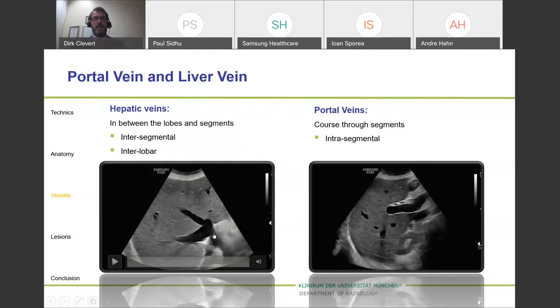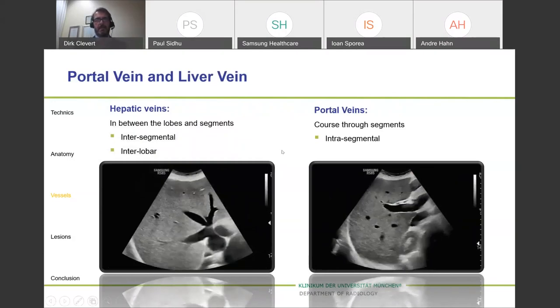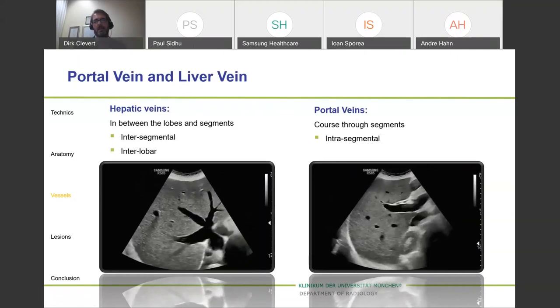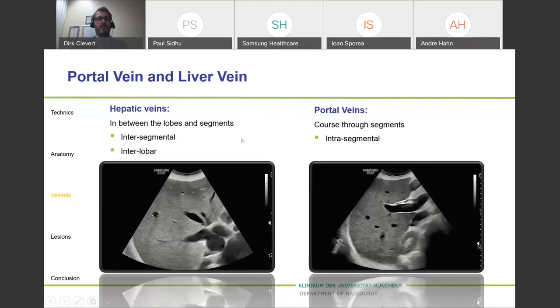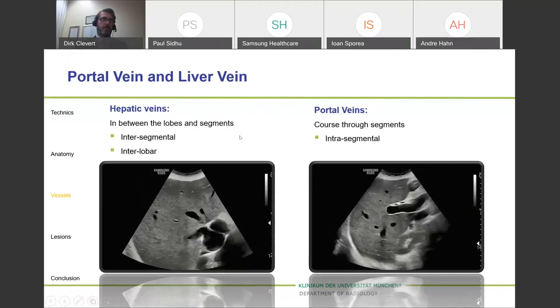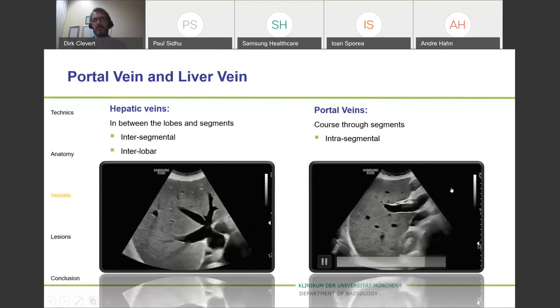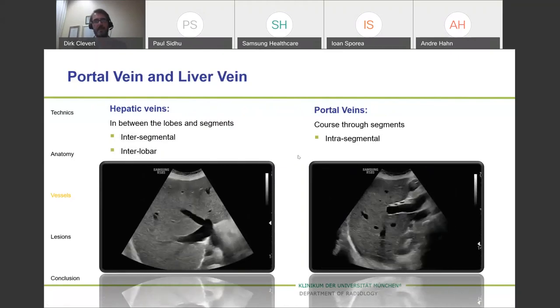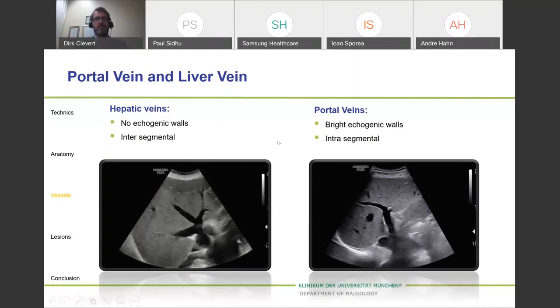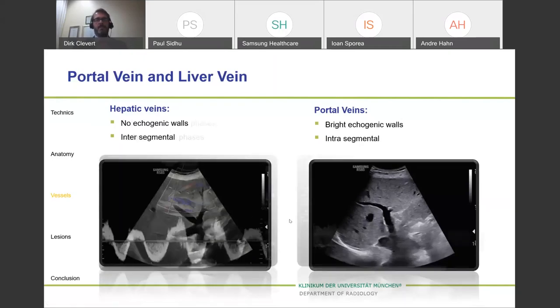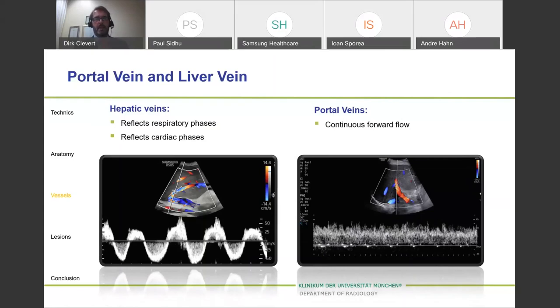What is the difference between the portal vein and the hepatic vein? This is important to clarify for students. The hepatic vein goes between lobes and segments — the blood supply is intersegmental and interlobar. Also, if you look at wall structures, the portal vein has bright echogenic wall structures, which are completely absent on the hepatic vein. Additionally, the flow pattern in pulse wave Doppler is completely different when comparing the portal vein to the hepatic vein.